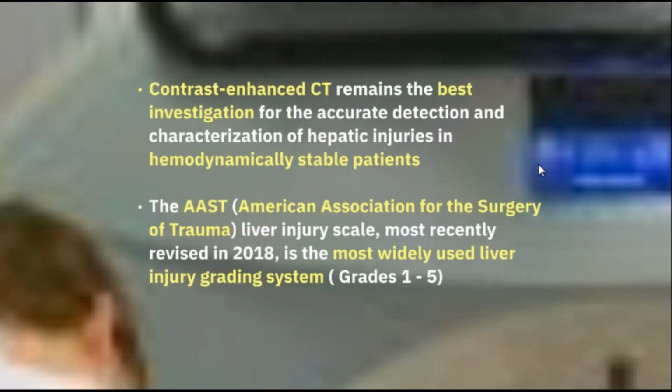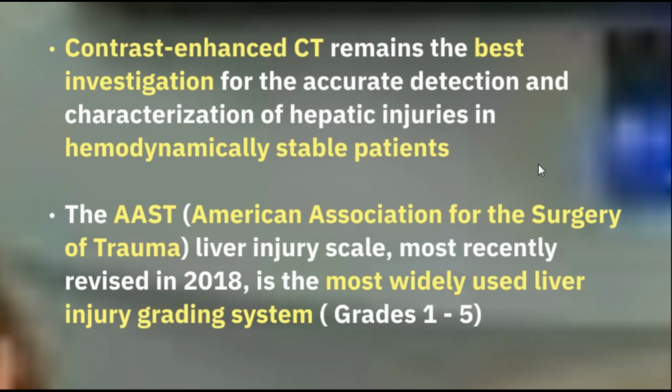Okay, so the lesson here is whenever you have one injury, never stop looking for other injuries. Not only liver injury. Check the spleen, check the pancreas, check the lung, check the rib, check the vertebra, check everything, okay? Injuries don't happen in isolation.